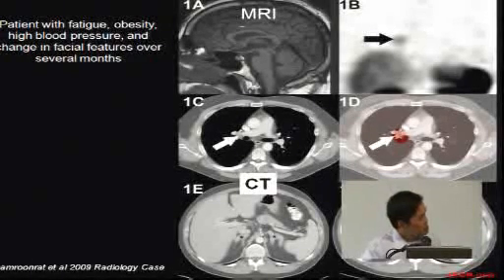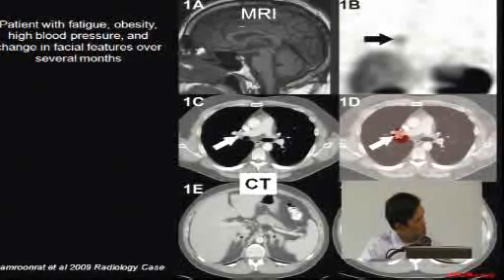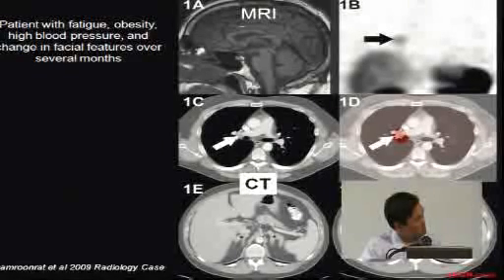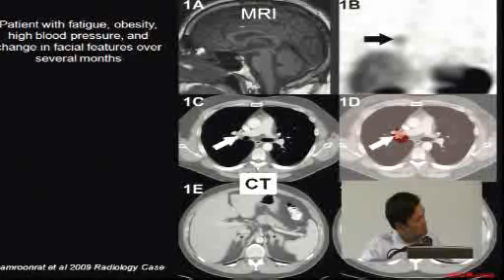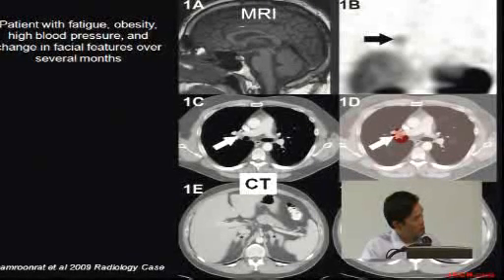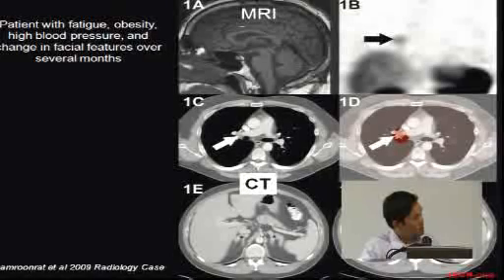In this particular patient, there's a white arrow here showing a tiny little 1 centimeter, less than a peanut size lesion here, wedged next to the bronchus and in between a vessel. And so this illustrates why we have to give patients contrast. If this contrast didn't exist in the vasculature, it would be almost impossible to see this tiny peanut-sized lymph node.